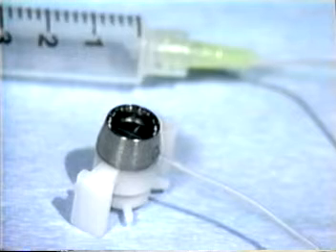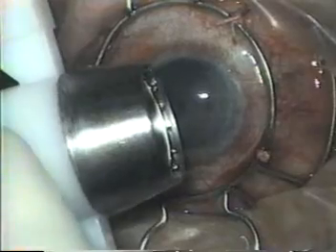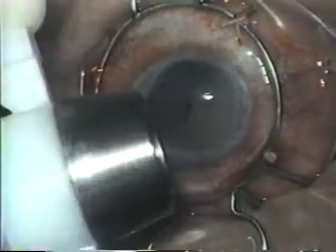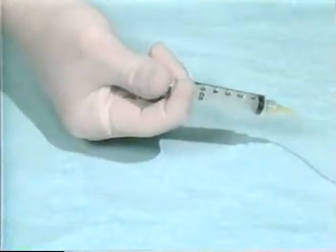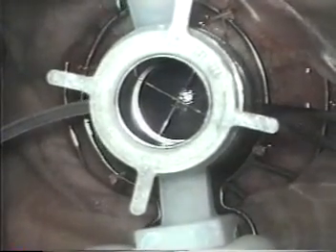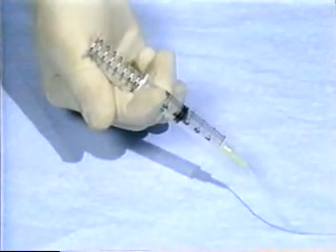Cutting and marking the recipient cornea with the trephine requires only a few simple steps. Before the surgeon places the trephine on the cornea, the edge of the blade is aligned with the bottom of the inner wall of the vacuum chamber. This position on the blade is called the zero position. The blade is then retracted three spokes and the plunger of the syringe is pushed in all the way. The crosshairs of the trephine are then aligned with a centration mark that has been made on the cornea.